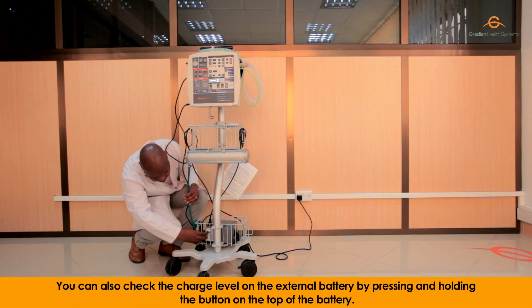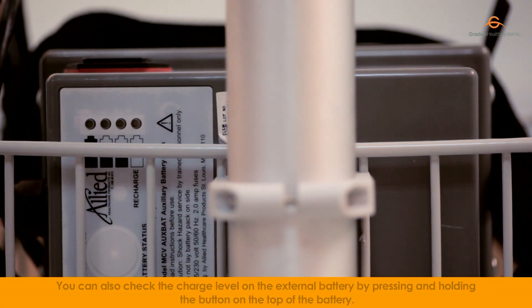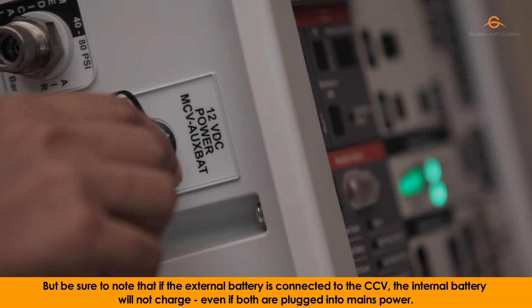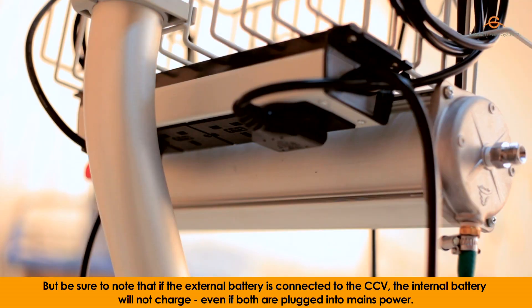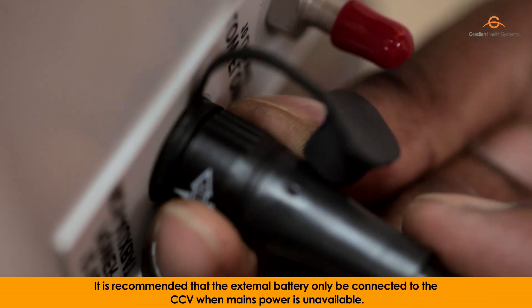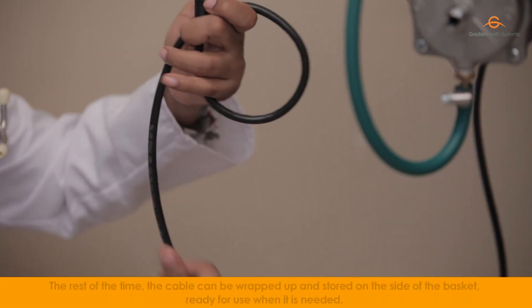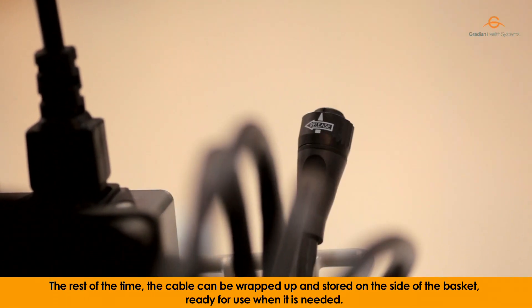You can also check the charge level on the external battery by pressing and holding the button on the top of the battery. If you need to use the external battery, simply connect it to the external battery port on the left panel. Be sure to note that if the external battery is connected to the CCV, the internal battery will not charge, even if both are plugged into mains power. It is recommended that the external battery only be connected to the CCV when mains power is unavailable. The rest of the time, the cable can be wrapped up and stored on the side of the basket, ready for use when needed.